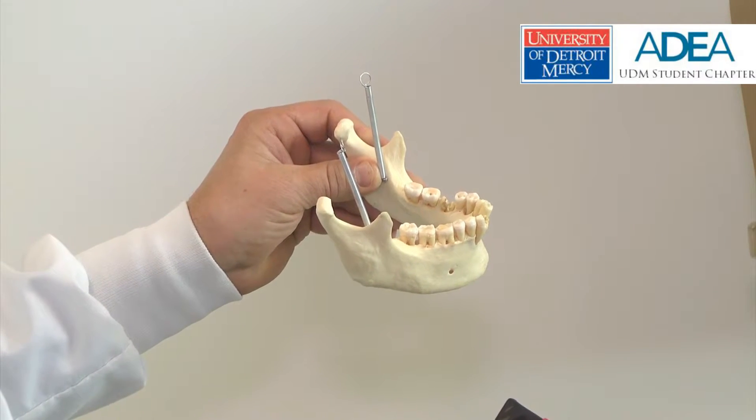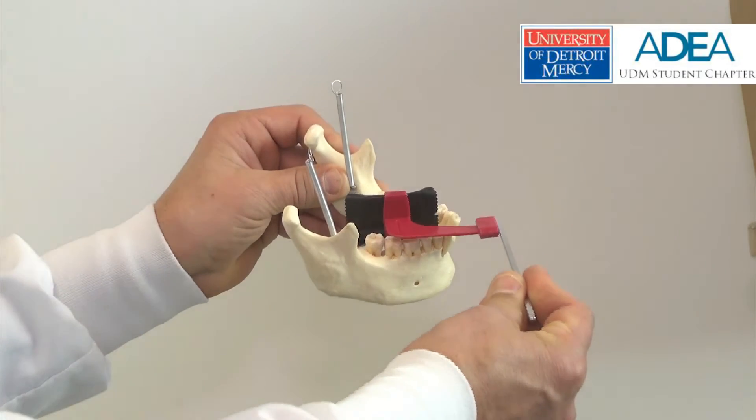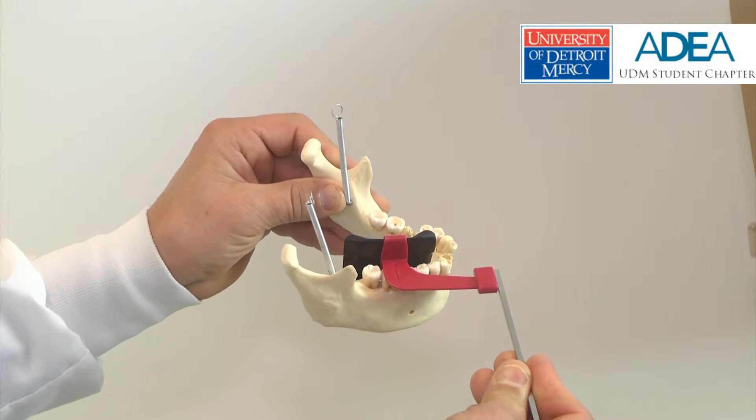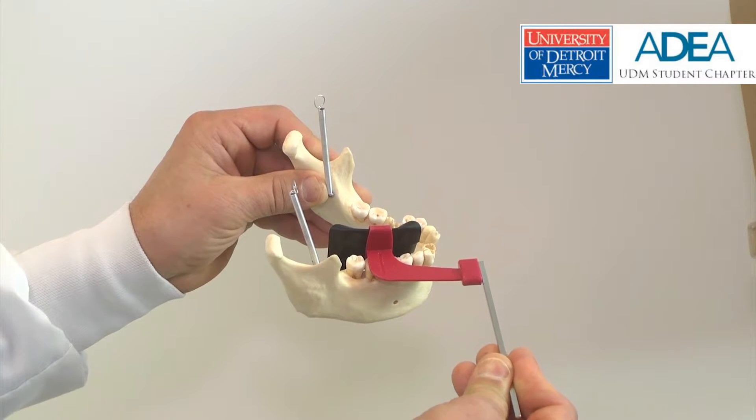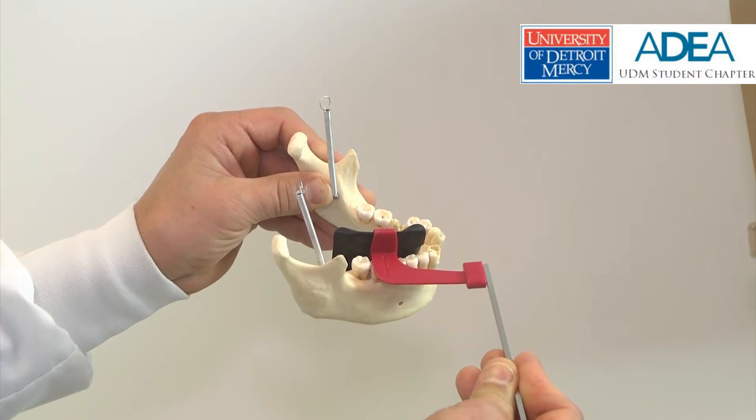Similarly, for the premolar bite-wing radiograph, the sensor is placed lingual to the teeth, and we see that the leading edge just captures the distal of the tooth in front of the diagnostic field.